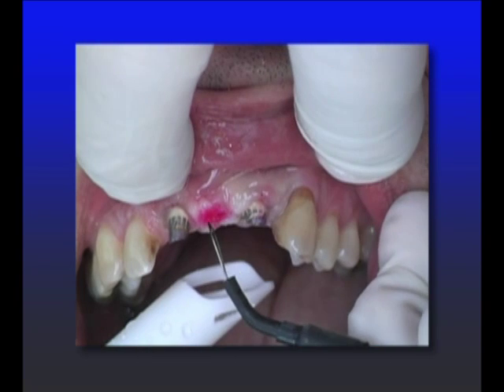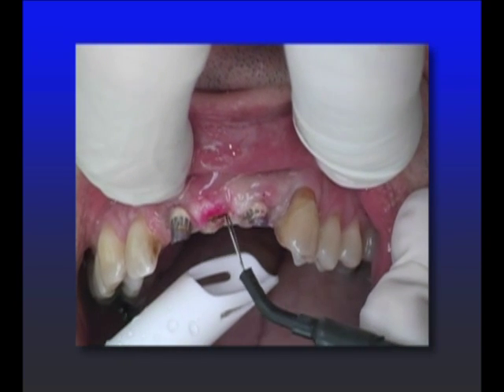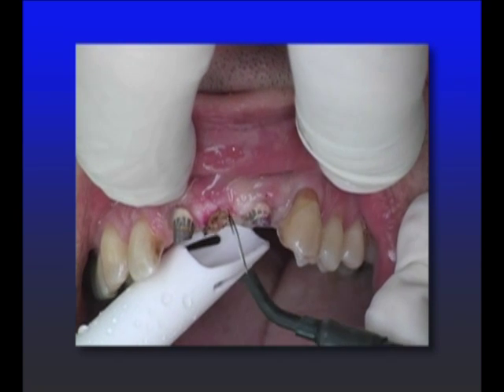Whether you do it with a burr, an electrosurge, or a laser — I've done it with all of them and it seems equally effective. This happens to be a loop on the electrosurge. So I remove the tissue and try the bridge back in.